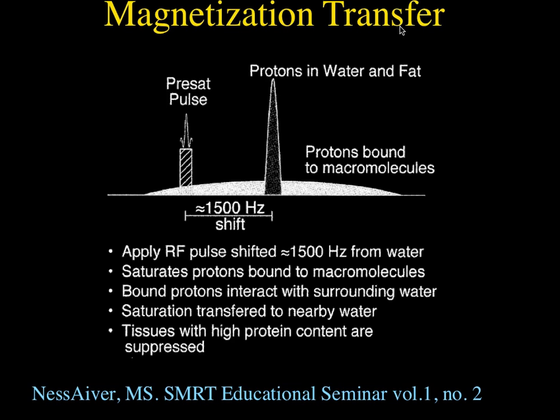Yeah, post-GAD, but it often has been used in the past in non-contrast angiography because it suppresses the background signal, making better contrast. Here, when you look at water in the tissues, you have a big peak from free water. But a lot of the water is not freely moving in space like in the bladder. A lot of the water is bound to macromolecules like within muscle and so forth, where they're fixed on or adsorbed onto large macromolecules.